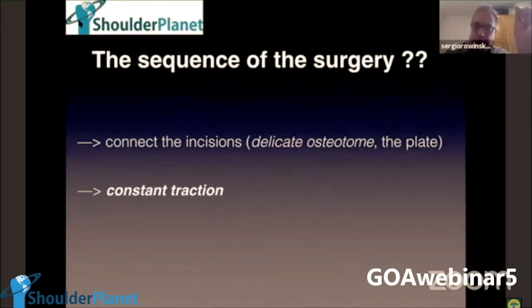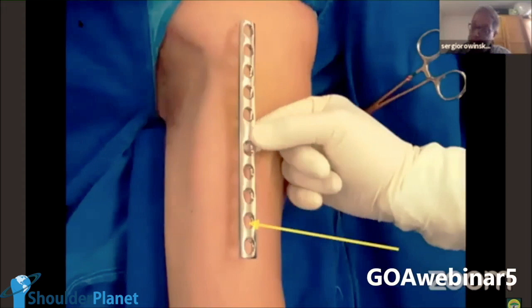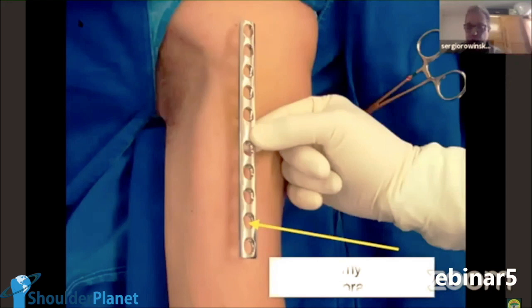So with which hole do I start? I always start with the upper hole of the inferior part. And why? Because I do so many difficult cases and distal cases that I have to have a perfect position of this hole. So I learned to do it like this, not from any book, in my mind, and it works wonderfully. So this is my first perforation, which can be done through the plate or freehand without the plate.